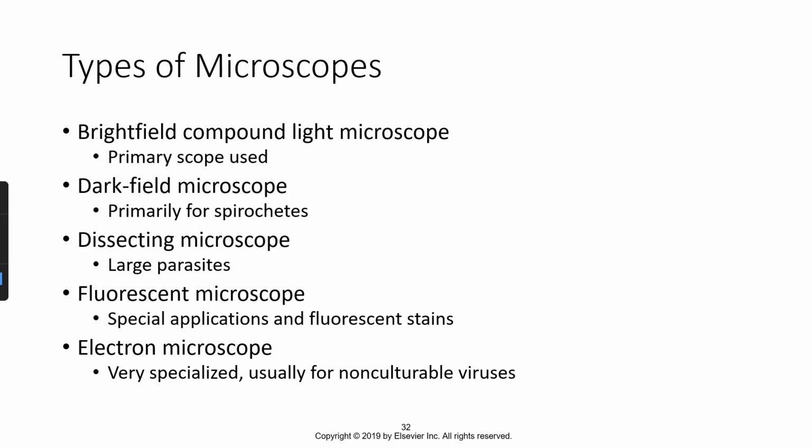Later on in the summer, closer into the fall, you're going to see more of the adult ticks. And there are a lot of different tick species. Not every tick species carries the bacterium that causes Lyme disease. So being able to identify those using that dissecting microscope is important.